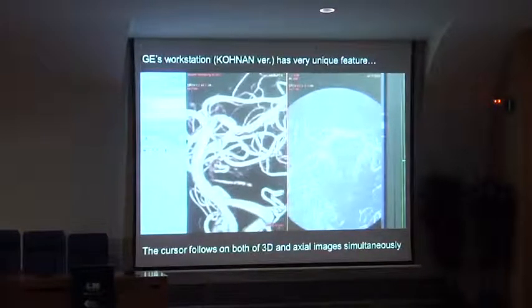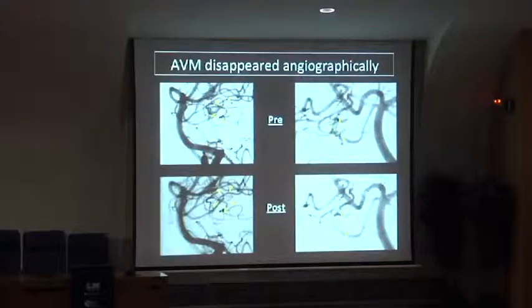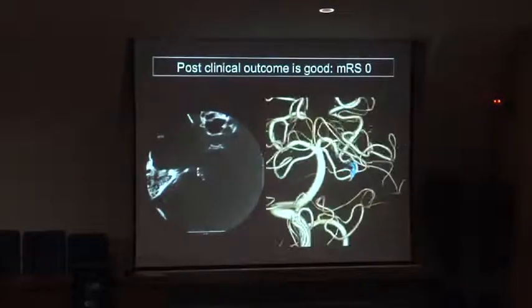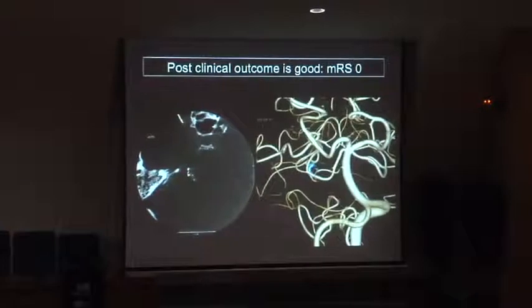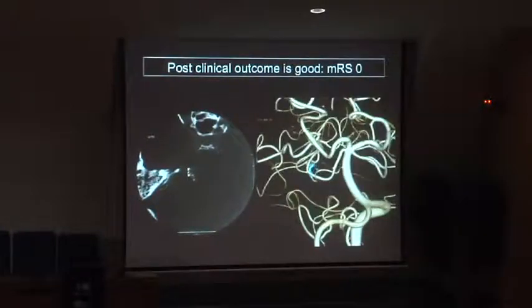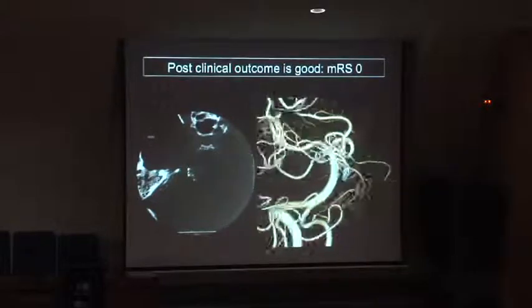We use this technique always. And after NBCA injection, the AVM disappeared angiographically. Post-clinical outcome is good, and the patient has no neurological deficit. You can see the nice NBCA cast.